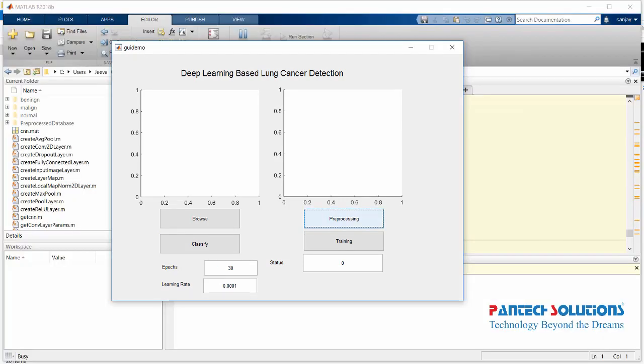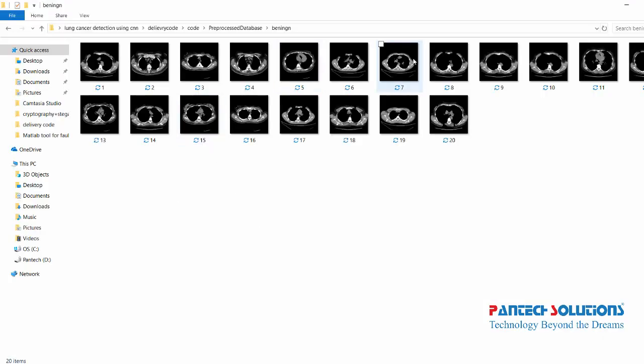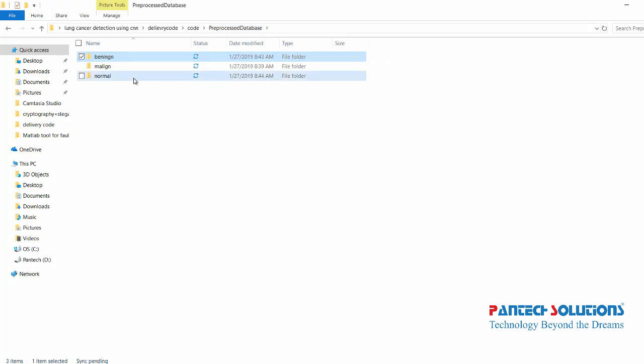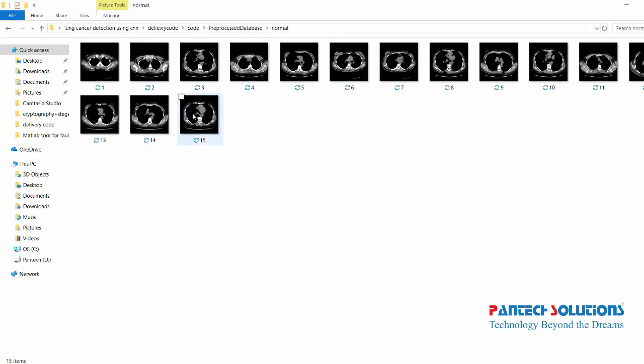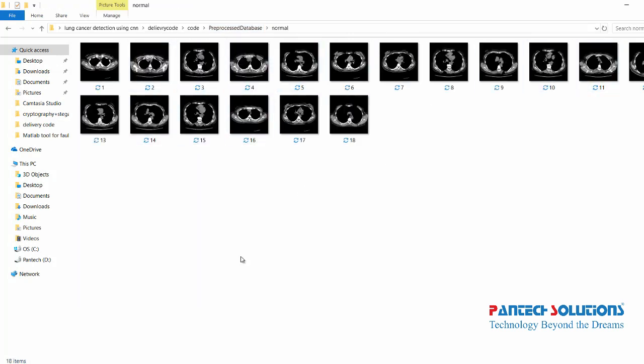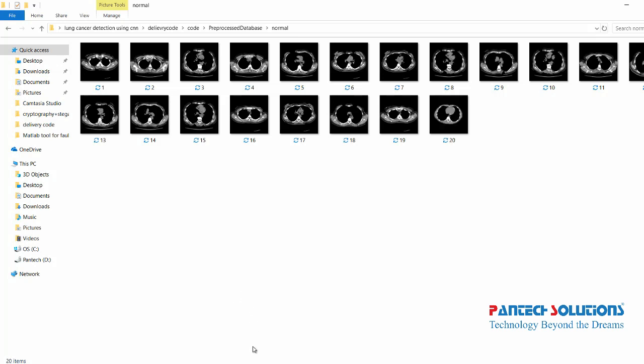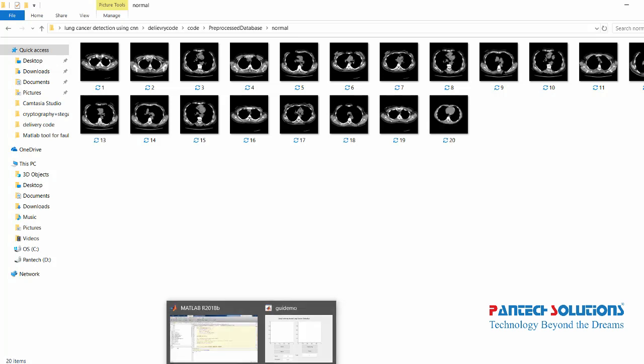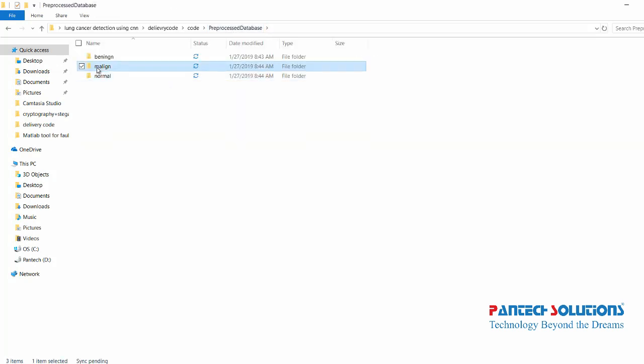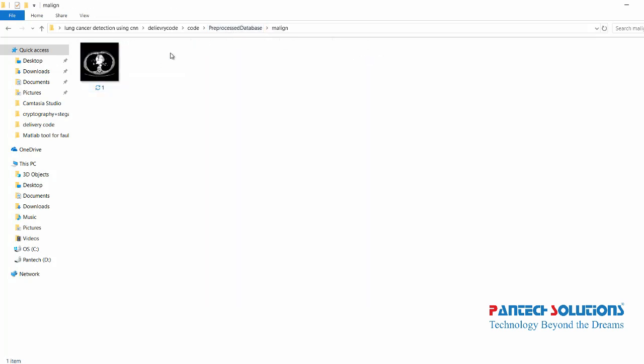It starts to load 20 images for benign, 20 images for malignant, and 20 images for normal. This process will run for 3 to 5 minutes.